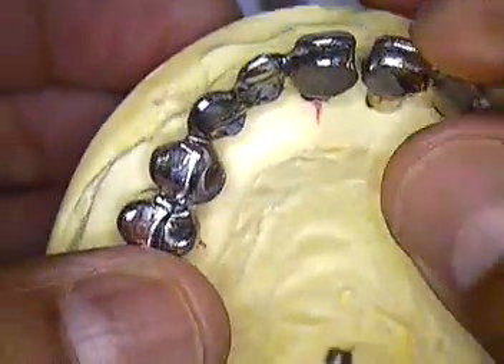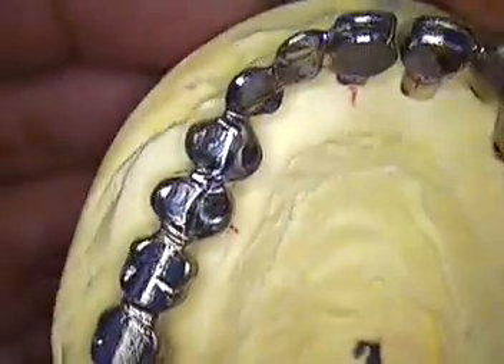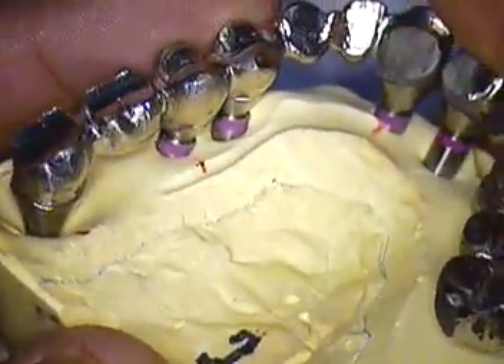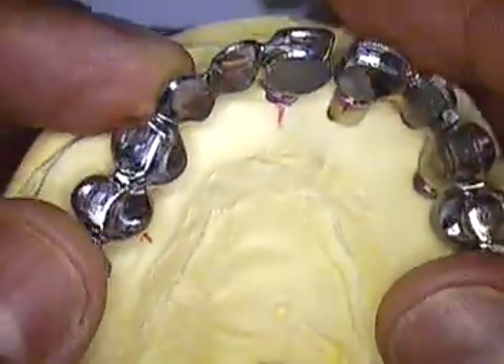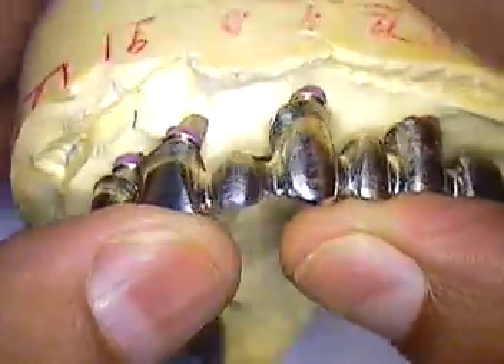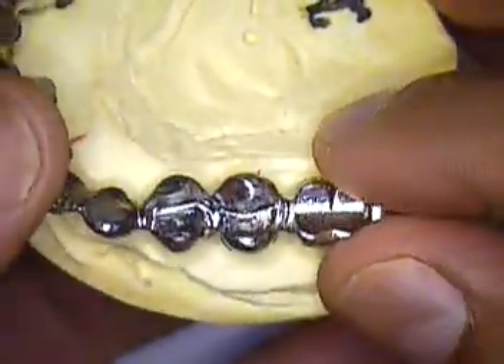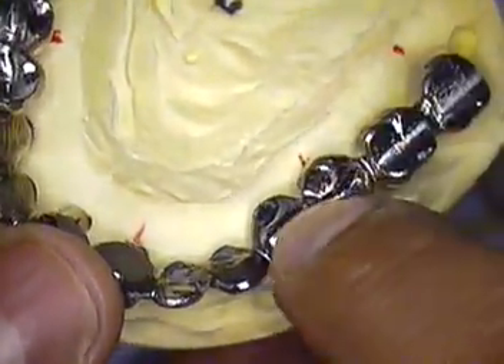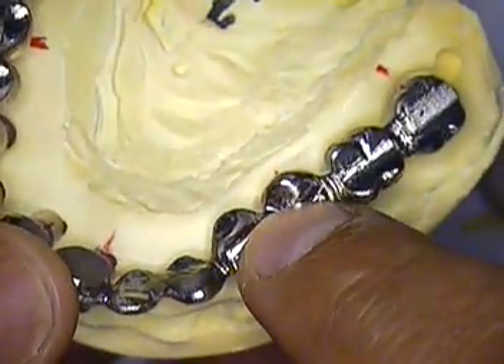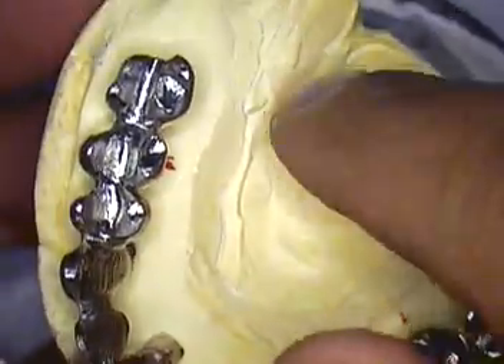We now have a nice framework for Ken's case, to which we're going to add porcelain. Ken is going to be coming in about 30 minutes, so hopefully we'll video that and show you how this is tried in the mouth, how we check the occlusion — which is important in Ken's case — to verify the mounting.